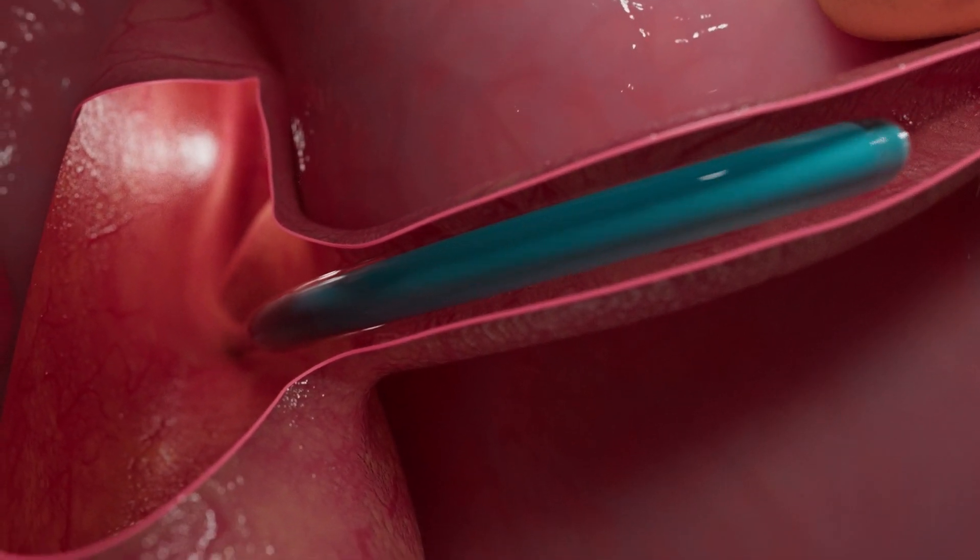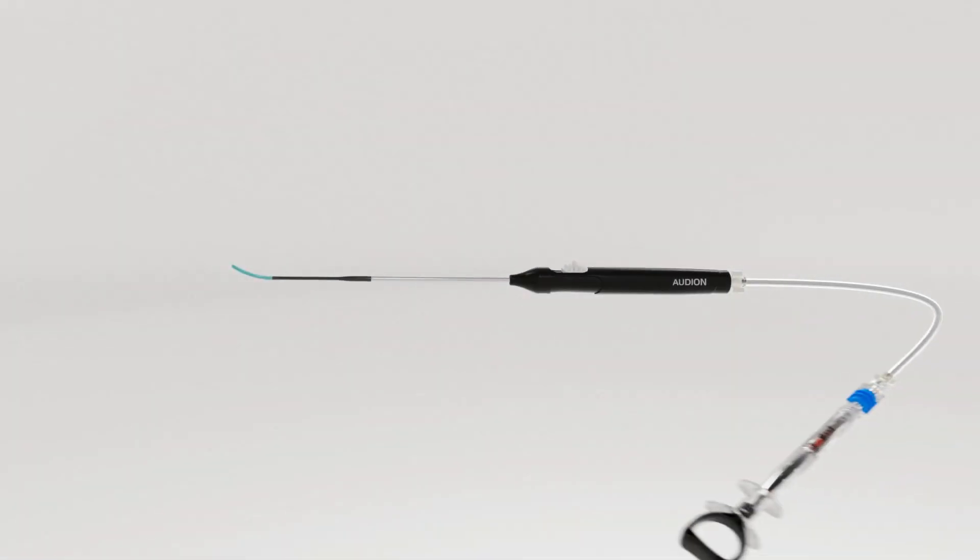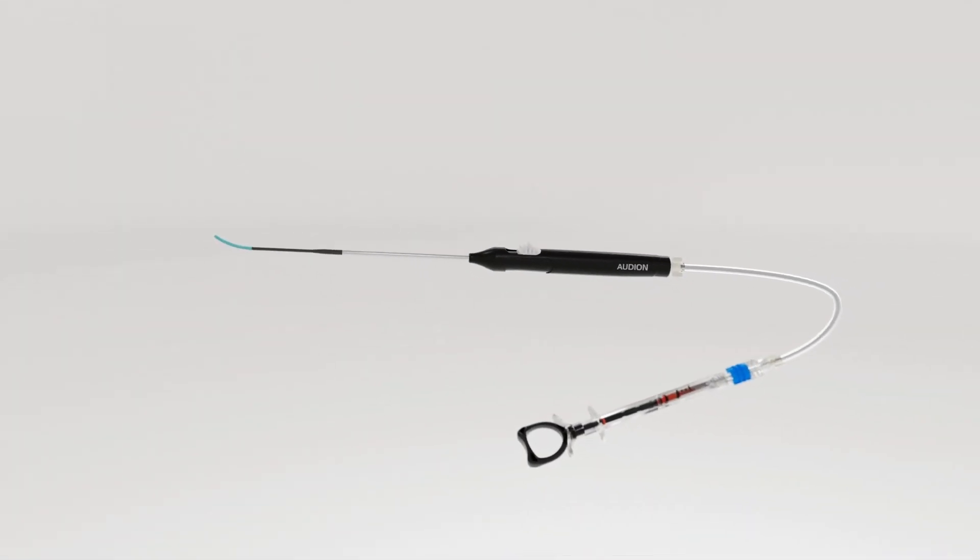After 2 minutes of dilation is complete, deflate, retract the balloon, and remove the device in the same orientation it was placed. Audion is a simple ET dilation solution.